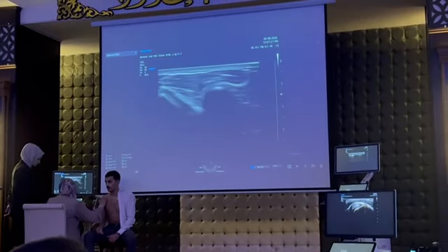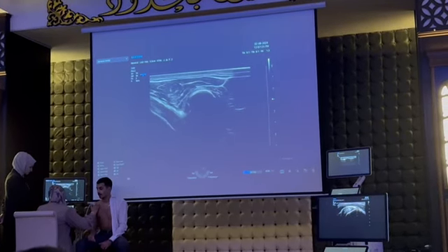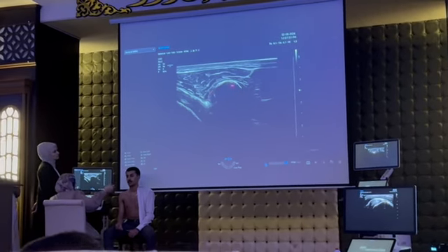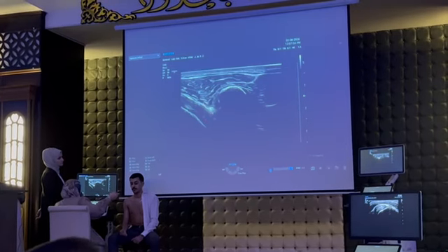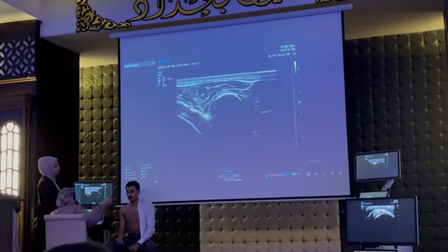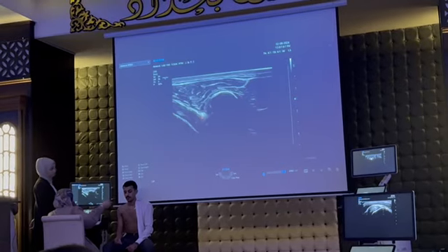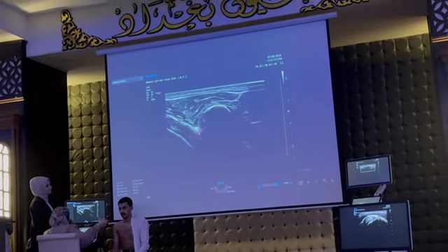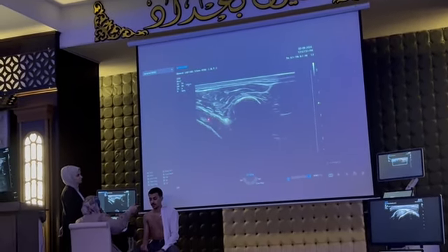So I go now medially till I reach the coracoid process. The white line is the coracoid process. Below this coracoid is the subscapularis muscle. Just above this subscapularis muscle is the coracohumeral ligament, this white line. Subjectively, it is normal, within normal thickness, no hypoechogenicity, no fluid collection. So it appears normal. Any white line that appears just above the subscapularis muscle is the coracohumeral ligament.